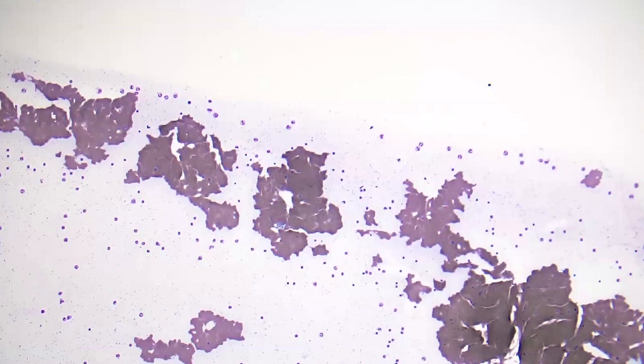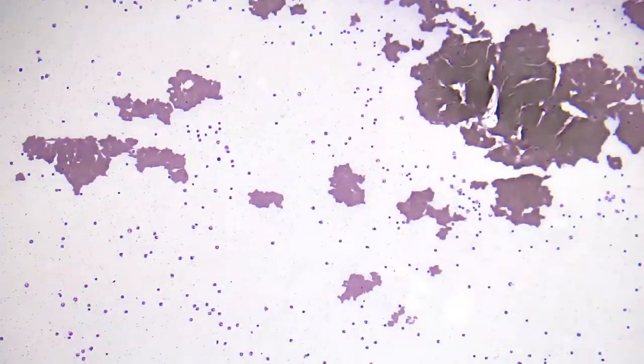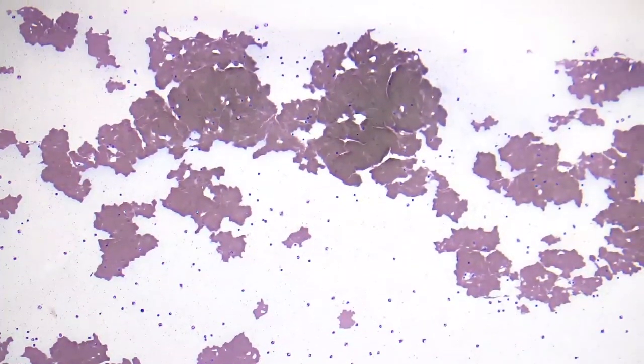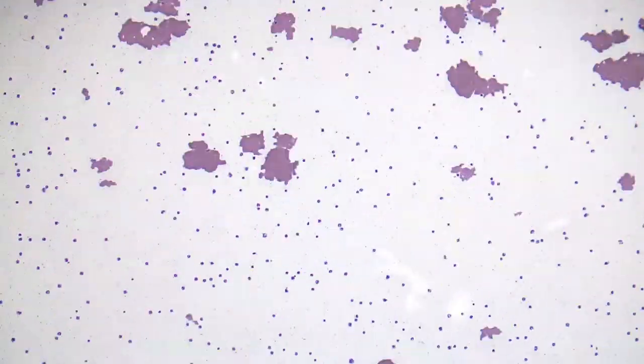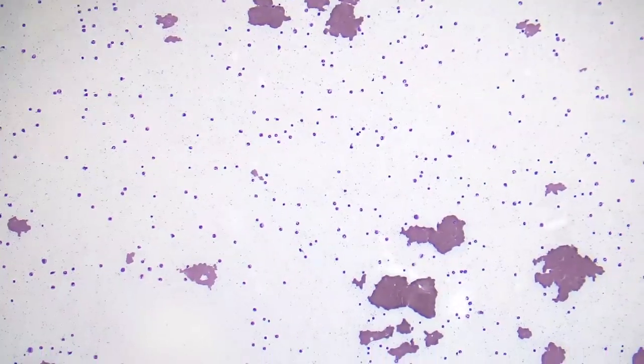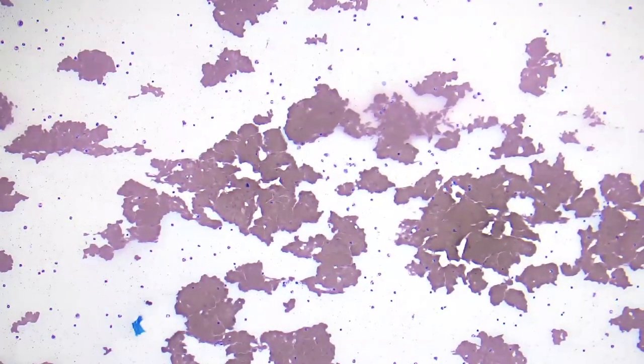So here's a case that arrives to you because it was flagged by a technician because the MCV was very high. And even at 10x, we can see the abnormality here. The main abnormality that we're seeing is the red cells are inappropriately agglutinating. And so you can see that there's tons of white space that's filled by white cells and platelets, and the red cells are all clumped together here. And so we call this red cell agglutination.